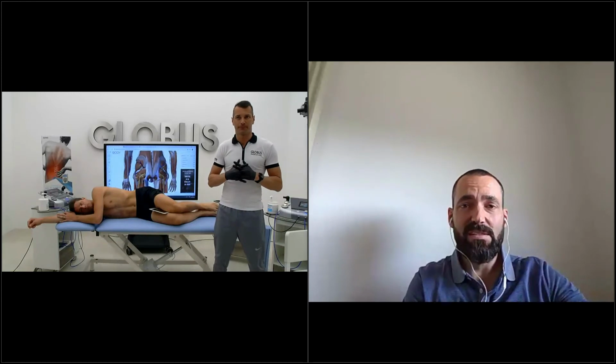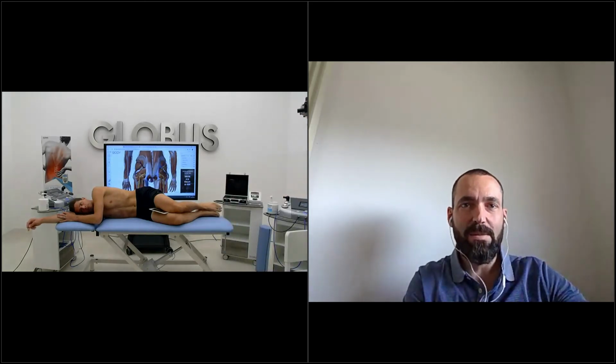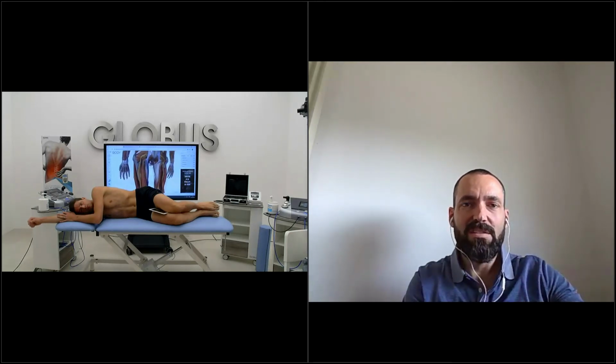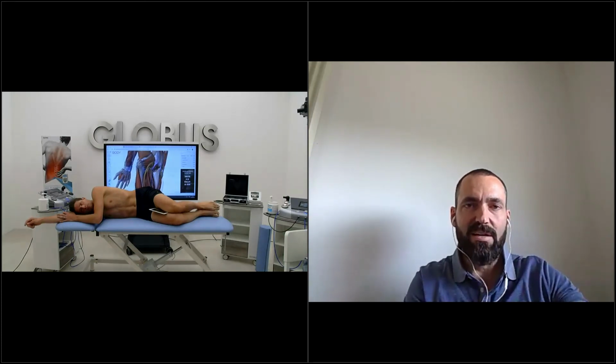Yeah, in some cases very good, because the next question is how many days of recovery between one session and the other. Again, the answer is it depends. It depends on the feeling. Usually, when I see the patient the next day, I ask, how was your feeling, your sensations? Did you wake up with some new pain? There can be some reaction after treatment. If you say no, it's nothing new, maybe I feel the same or a little bit better, so I do it again, and the next day one more treatment.